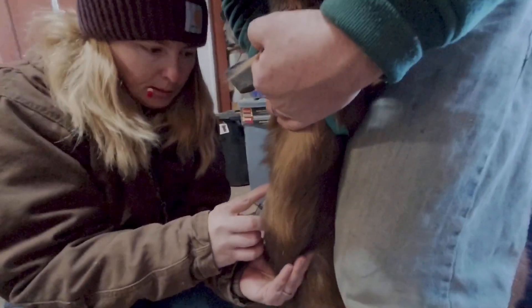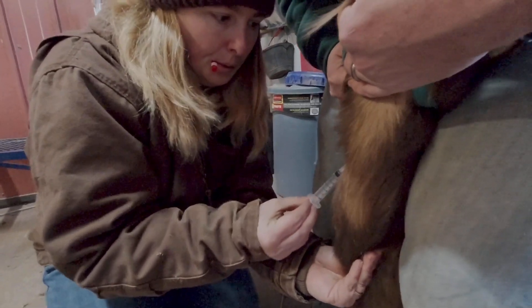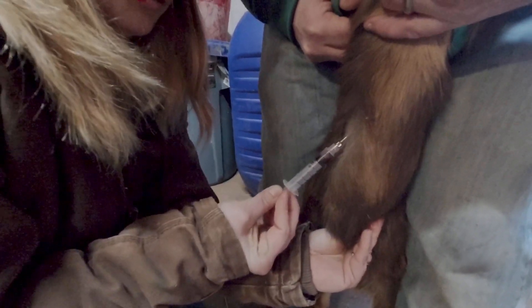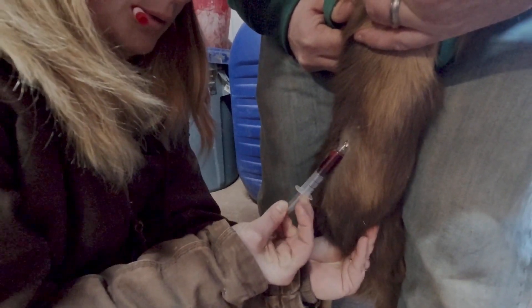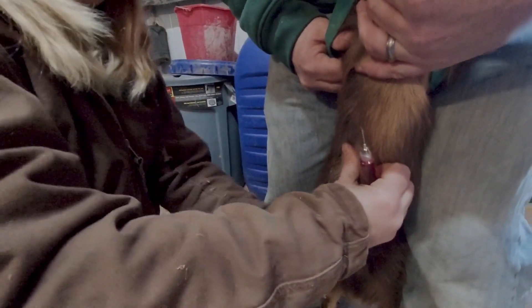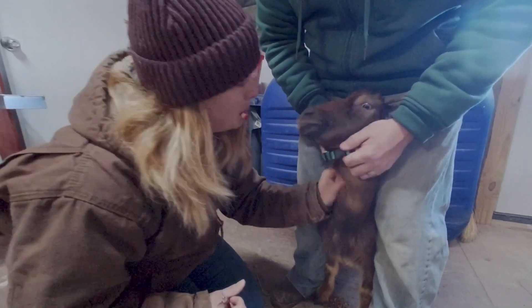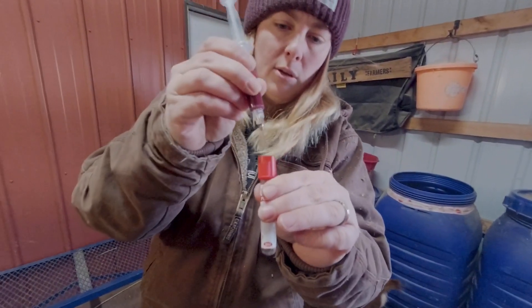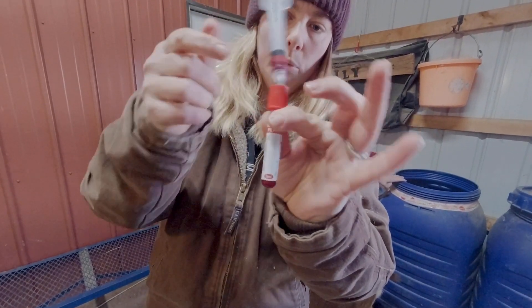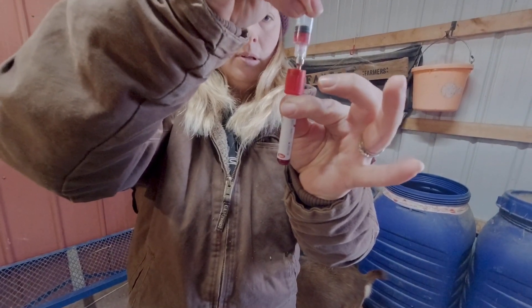Smoothly insert your needle in an upward motion into the jugular vein up towards the jawline — it should feel soft. Once you see blood entering your syringe, hold your needle still and gently draw down the plunger. Once you've drawn the appropriate amount of blood, remove the needle and hold pressure on the puncture site as it may bleed a little — you may need cotton balls or swabs ready to staunch the blood flow. You can then place your syringe into the top of the red top tube, and because it's vacuum sealed, it automatically pulls in all the blood.